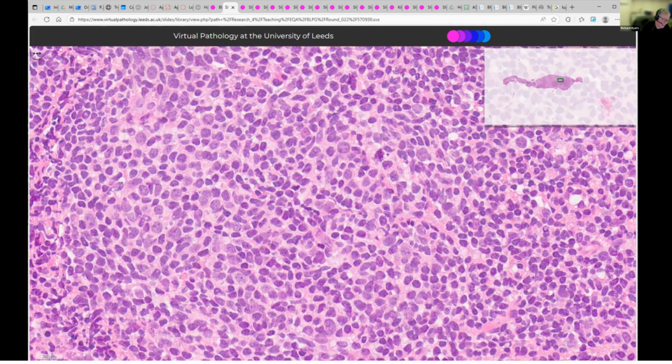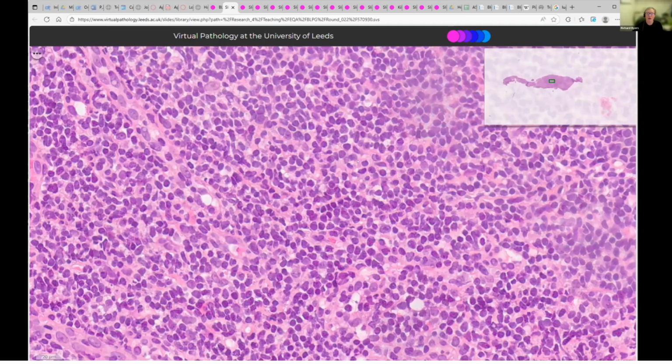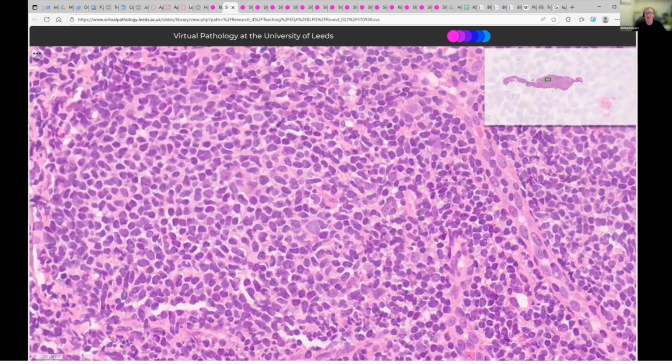So that's the way I look for that in these. I look to see, have we got cells with a long axis? Yes. Have some of them got little grooves in them? Yes. They're probably centrocytes. Have we got some large cells? Well, we've got that one there, that one there. We may have others in the other follicles. Not as many centroblasts as usual, actually.